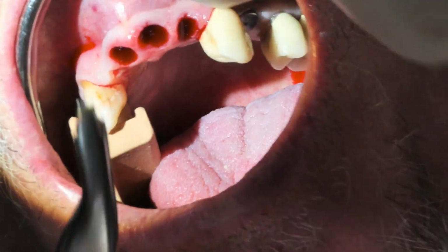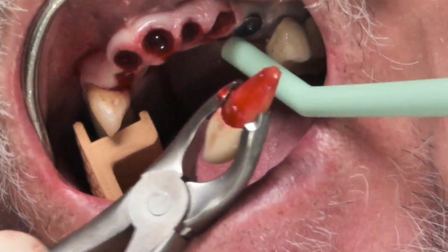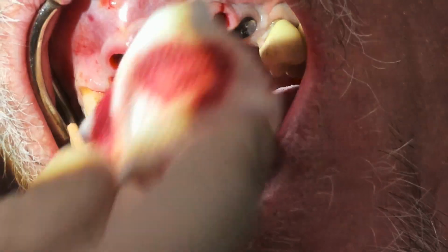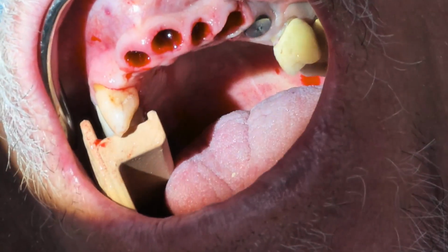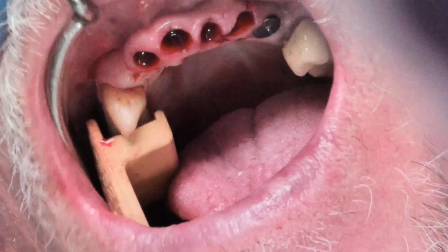Take this in and just relax a second. So what I was just using is an elevator. This canine, old post and core, and one of the things we want to do is atraumatically get those teeth out because our tissue contours are never going to be that good. So actually the canine, I got it, it went a little bit better than I thought, okay? So now we know where our sites are in the anterior. But what we're going to do is something very important.